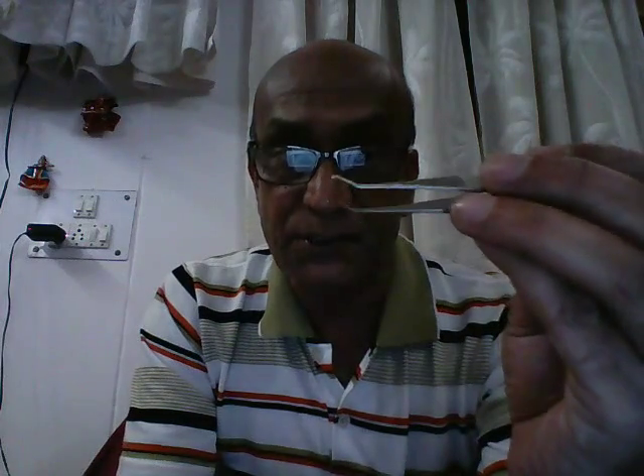Next, if we were to look between the two prongs, we see a small projection here. This projection determines — it governs the maximum pressure that we can apply between the prongs of the forcep.